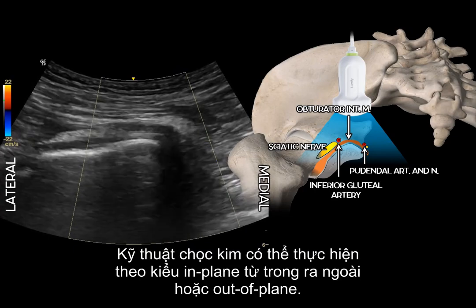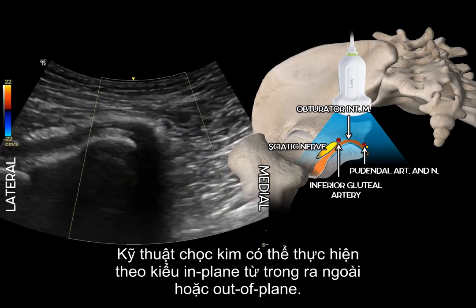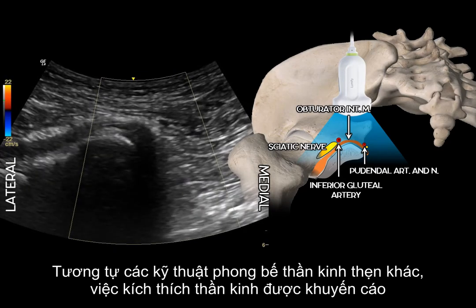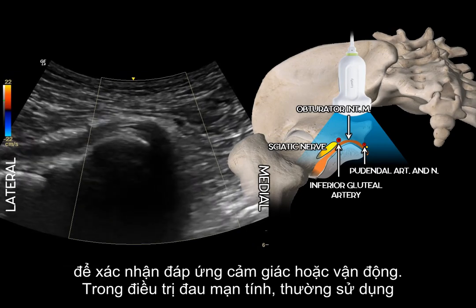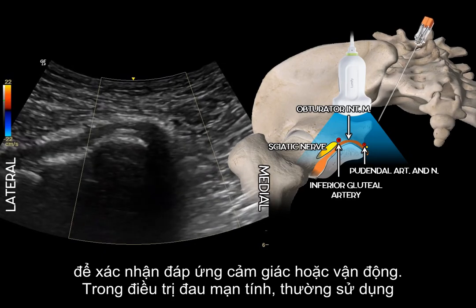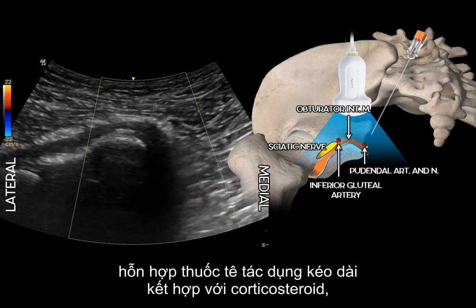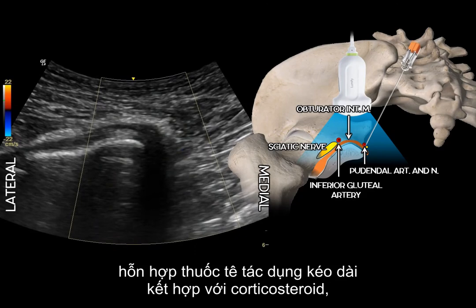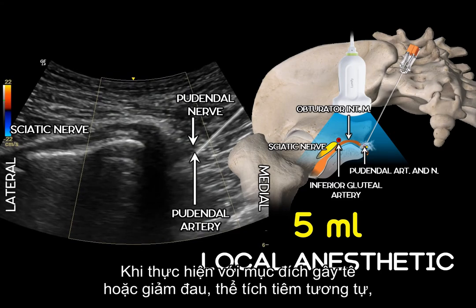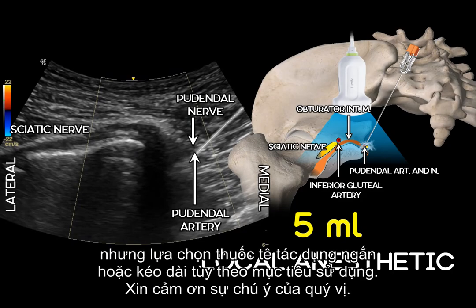The approach will be performed in plane, from medial to lateral or out of plane. Same as any pudendal approach, nerve stimulation is advisable to confirm sensitive or motor response. For chronic pain, a mix of long-acting local anesthetic and steroid is used in a volume ranging from 4 to 6 cc's. When it is performed as an anesthetic or analgesic technique, the same volume will be administered, but using a short-acting or long-acting local anesthetic depending on the purpose.